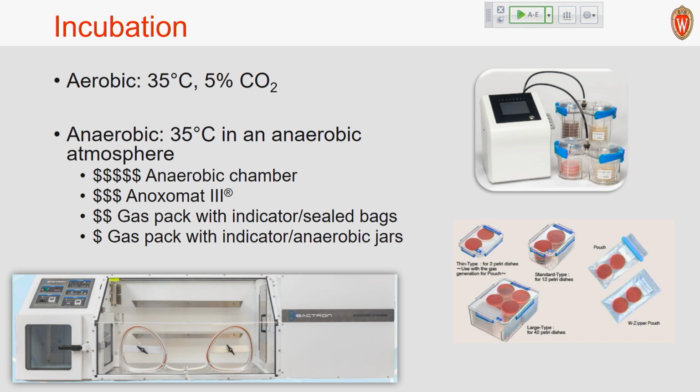I haven't used this Anoxomat 3. Has anyone used it? Yeah. And you've had success with it? You like it? Yeah? Okay. Basically, it's a way of creating an anaerobic environment within these vessels or containers. And then, of course, we have the jars and the bags with the anaerobic generators, and that's what a lot of us use.